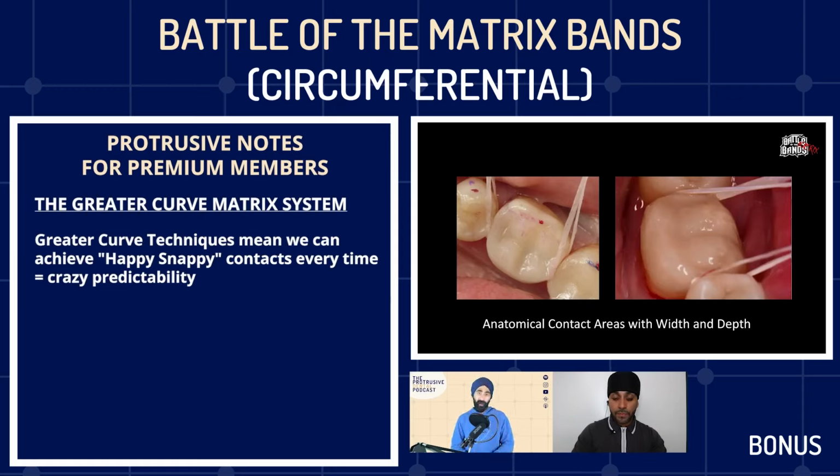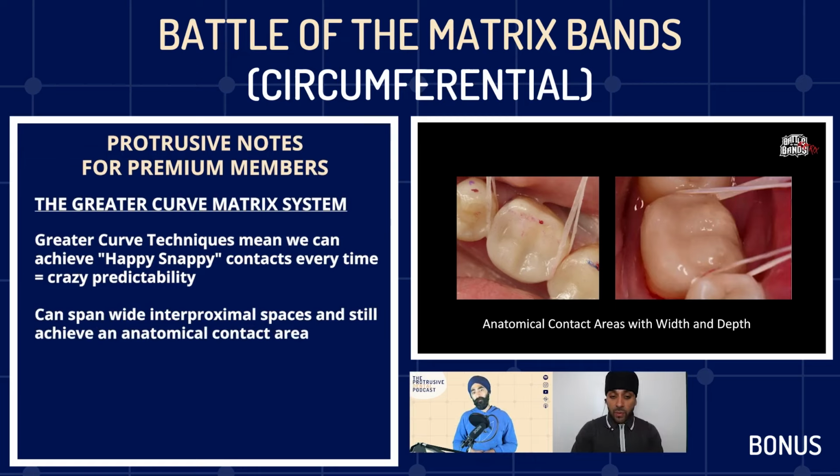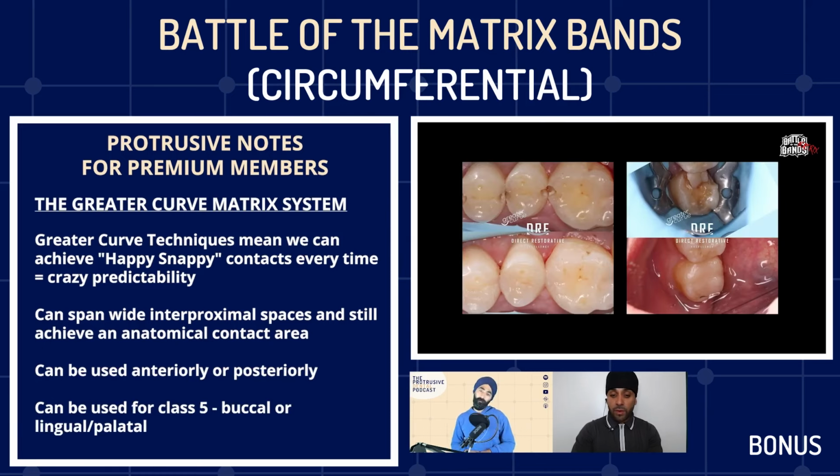Thanks for sharing that. As we move to the final phase of this podcast, just give us those nuances, because now you've probably piqued everyone's interest about the greater curve. Give us those indications, because you said you use it for everything, which is really clever. Just tell us what makes it so versatile. And so the greater curve can also span wide interproximal spaces and still achieve an anatomical contact area. It can be used anteriorly, posteriorly, and for class 5, whether they're buccal, lingual, or palatal.